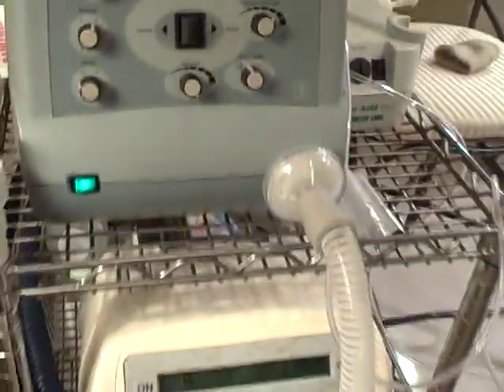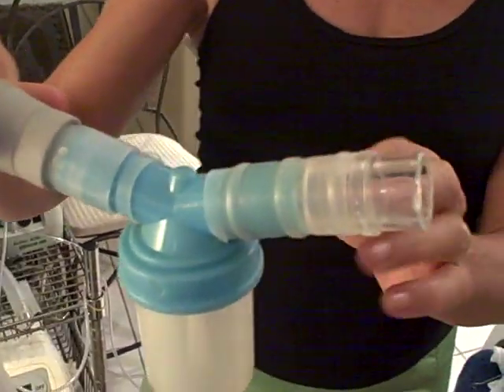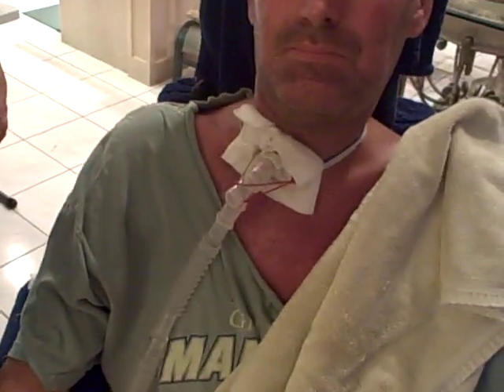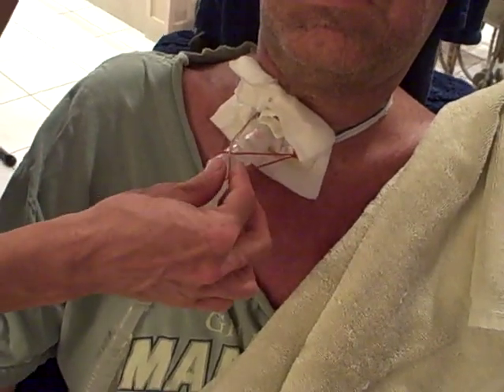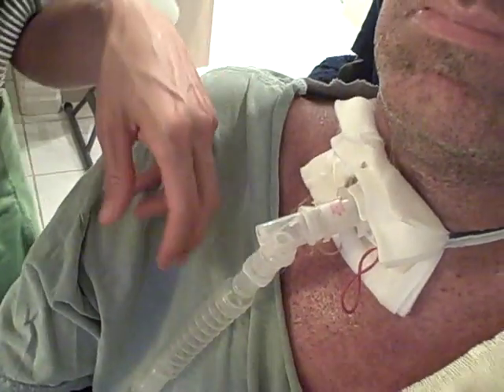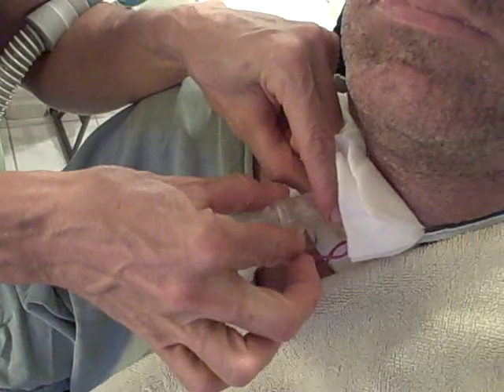The hose is hooked up, and then the canister. Matt has a number six trach, so this fits right onto the trach, which I'm going to go ahead and start showing you. This is something a professional would need to show you how to do and how many times, but we've been doing this for four years. Just take the trach off.